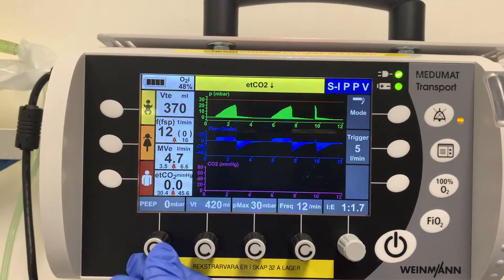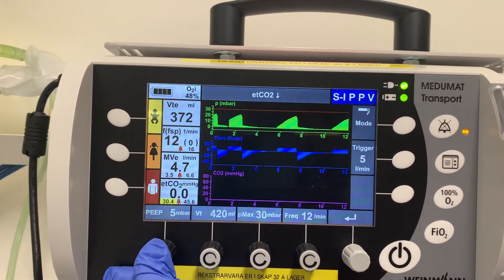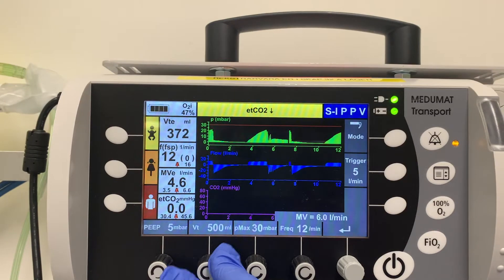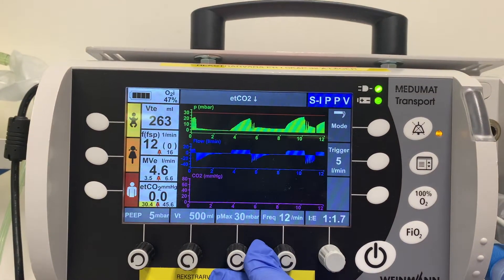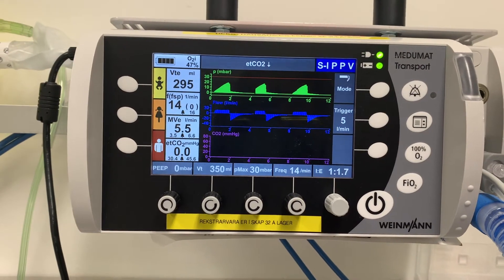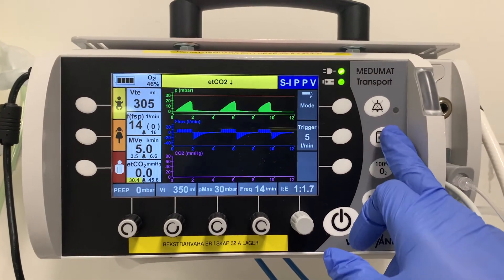To adjust PEEP, just rotate the dial and confirm — let's say to 5. To adjust tidal volume, same thing, then confirm. You can also adjust Pmax and frequency the same way by confirming each change.